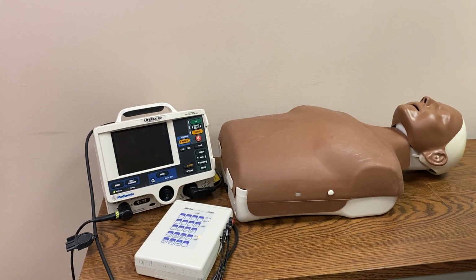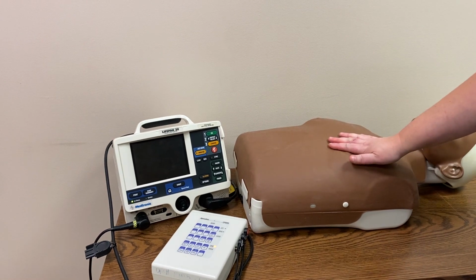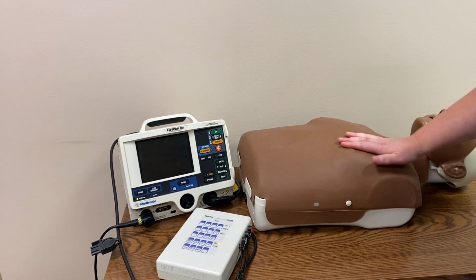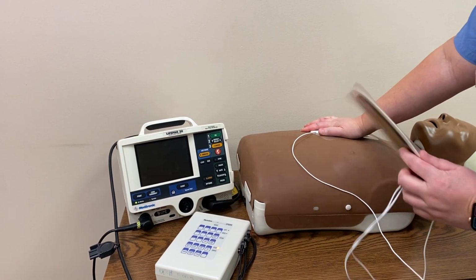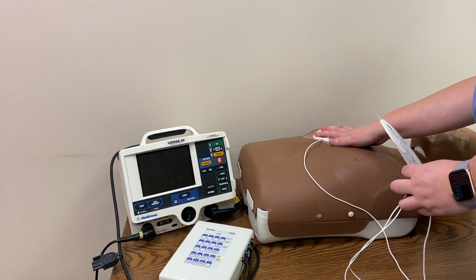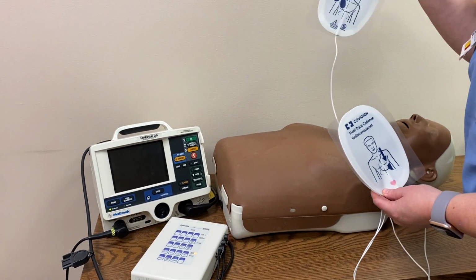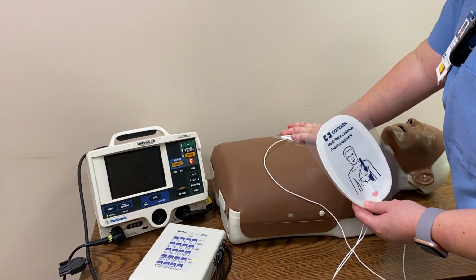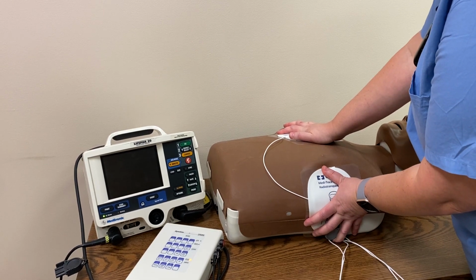So one of the things you need to do is clear the skin. If you have somebody who has a lot of chest hair, you do need to make sure that you shave the chest because you do need good adherence to the skin with these patches. So once you shave the skin, you're going to place the patches, and you do need to make sure that the patches are placed how they are on the pictures. So you're going to place them anterior and lateral.